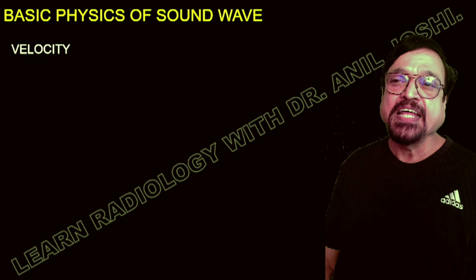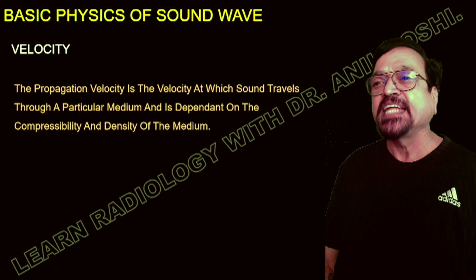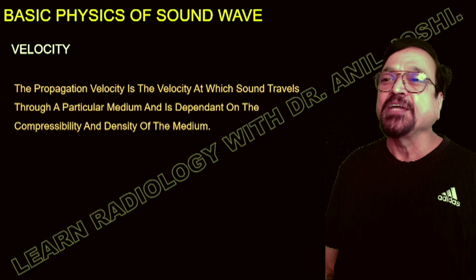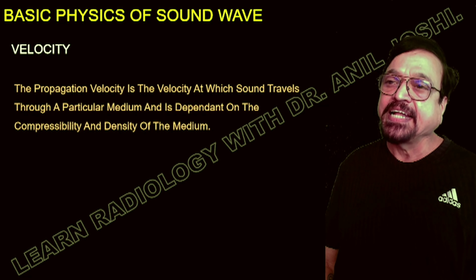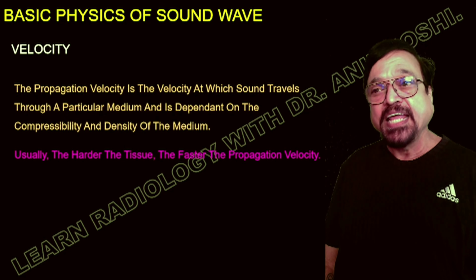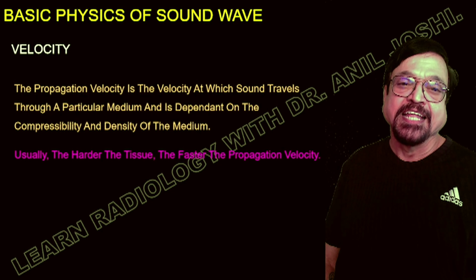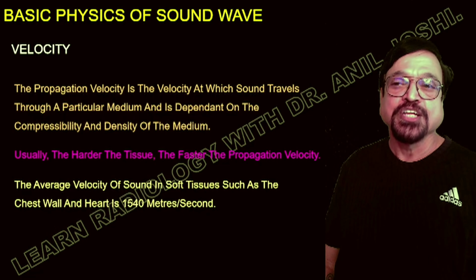Now coming to the velocity. What is the velocity? The propagation velocity is the velocity at which a sound wave travels through a particular medium and is dependent on the compressibility and density of the medium. So these are the two things which we must know. Usually, the harder the tissue, the faster will be the propagation. So it will be more in the bones as compared to the soft tissues.